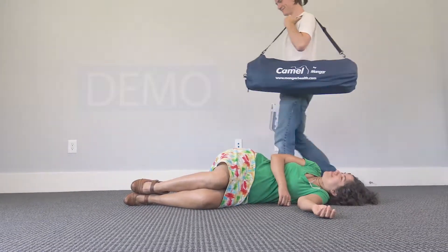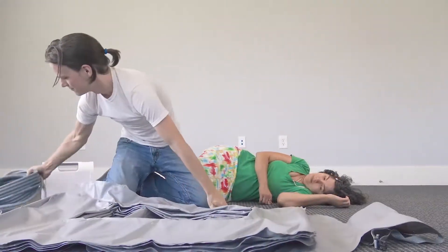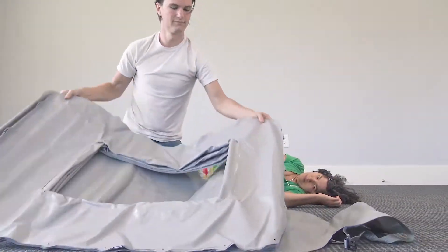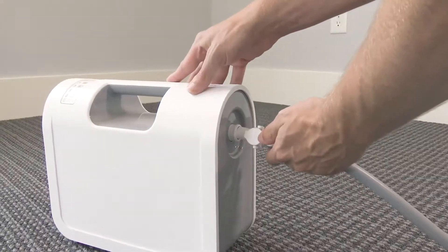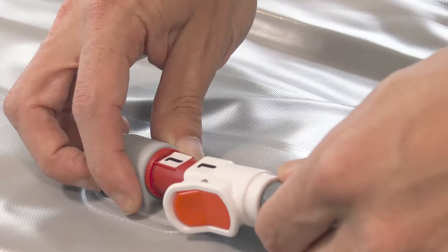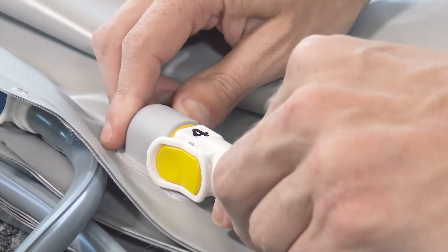To operate the Camel, first unfold the lifting cushion beside the patient, lining the logo up with the patient's head. Connect the four-way hand control to the compressor and the lifting cushion using the numbers and colors as your guide. Then turn the compressor on.